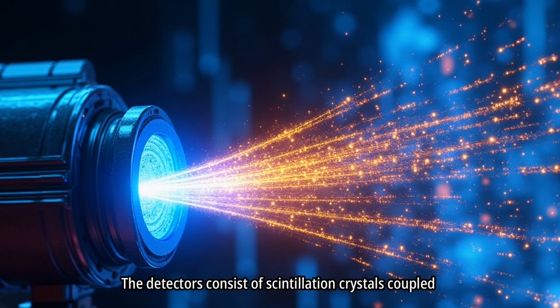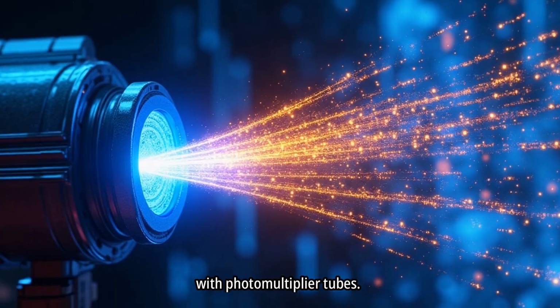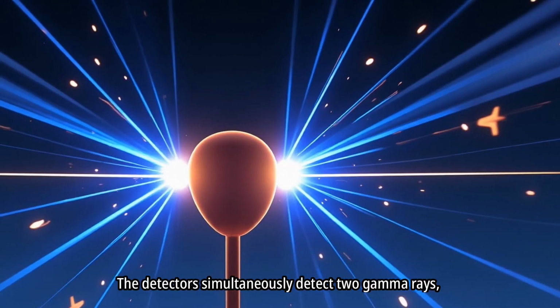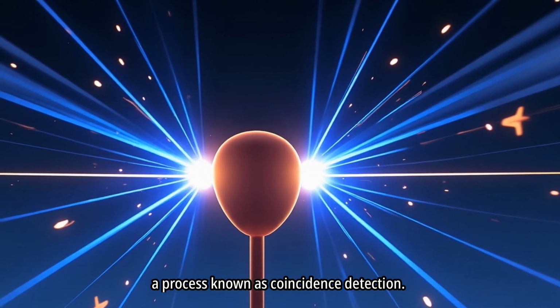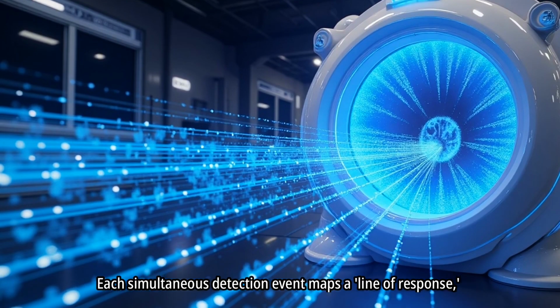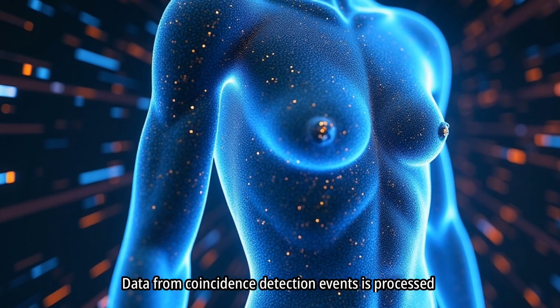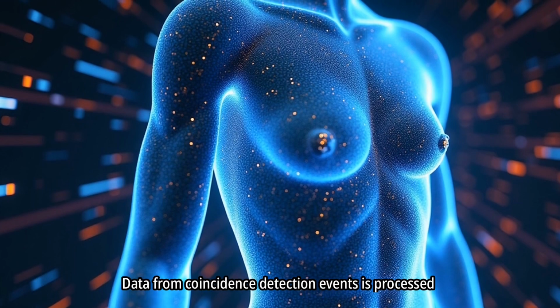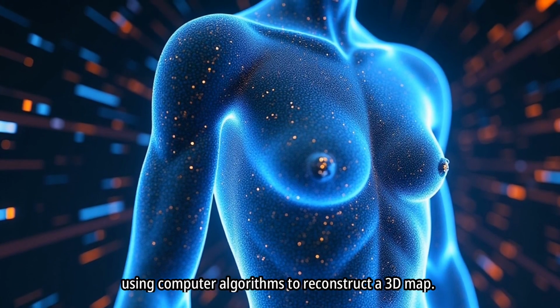The detectors consist of scintillation crystals coupled with photomultiplier tubes. The detectors simultaneously detect 2 gamma rays, a process known as coincidence detection. Each simultaneous detection event maps a line of response, and millions of these events are collected during a scan. Data from coincidence detection events is processed using computer algorithms to reconstruct a 3D map.